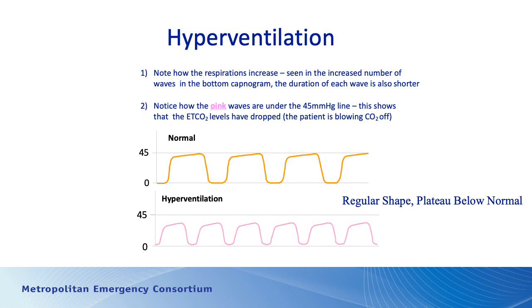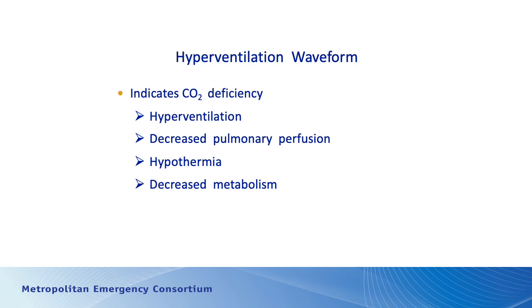But the waveforms are fairly normal in appearance, but the CO2 is below the expected normal of 40 to 45. So the plateau is lower than expected. This is a patient who is hyperventilating and blowing off carbon dioxide. So that waveform indicates the patient is hyperventilating.